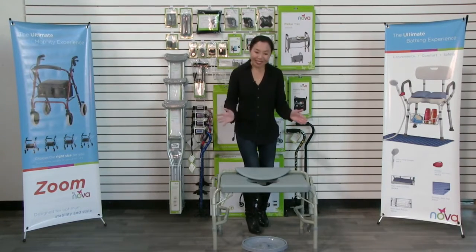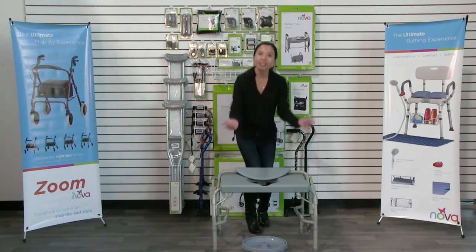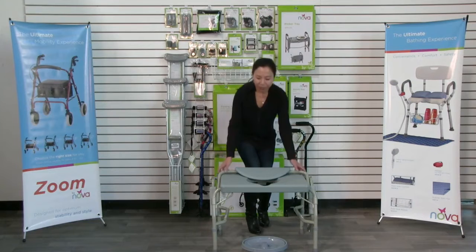The great news is that when you get this product, it's already assembled. It comes out of the box just like this — you just have to remove the light packaging.